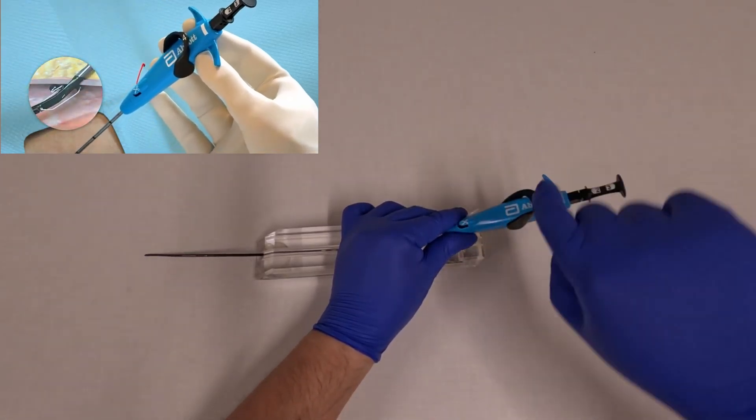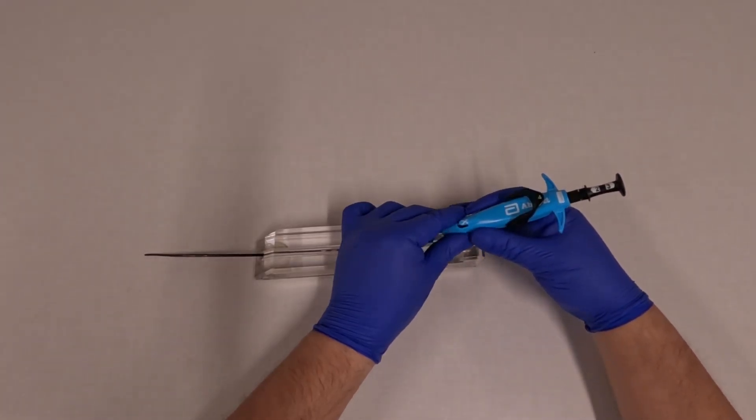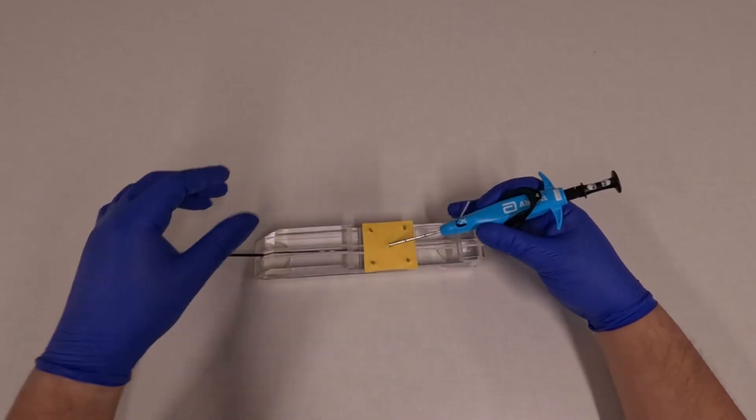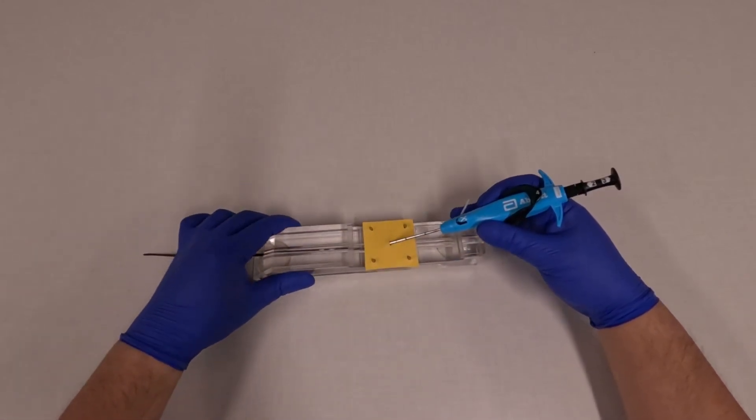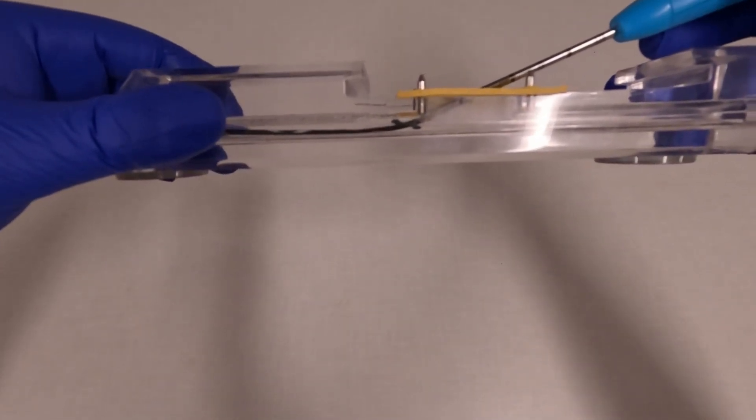At this point you want to deploy step one, which is the footplate. You do this by pulling back on that lever. Now we're going to take a look inside. You can see the footplate deploy here inside the lumen of the vessel.